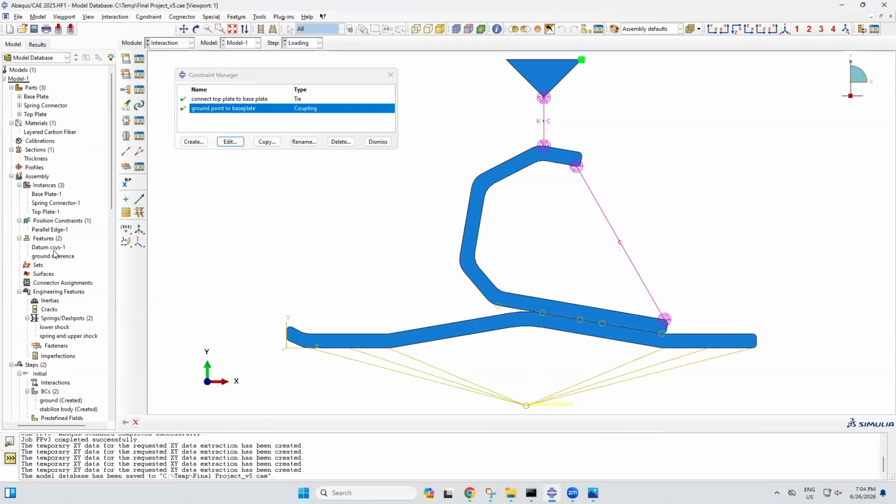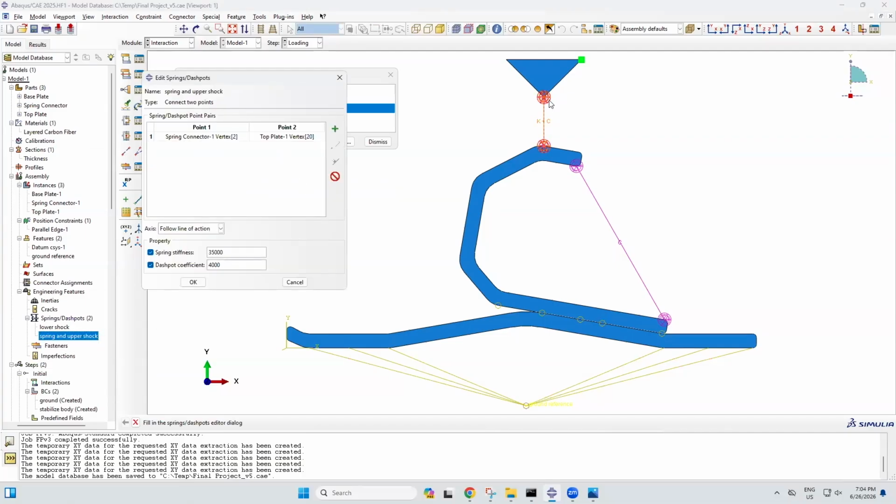Within the interaction, I also created a spring, which is called the spring and upper shock. This spring connects the spring connector and the top plate. It is the only spring in the prosthetic.